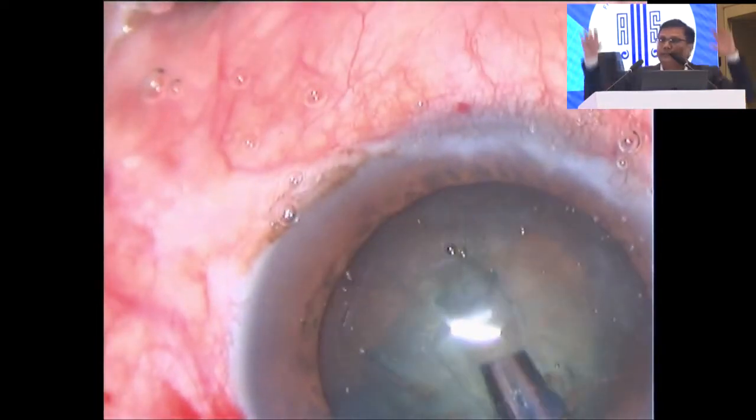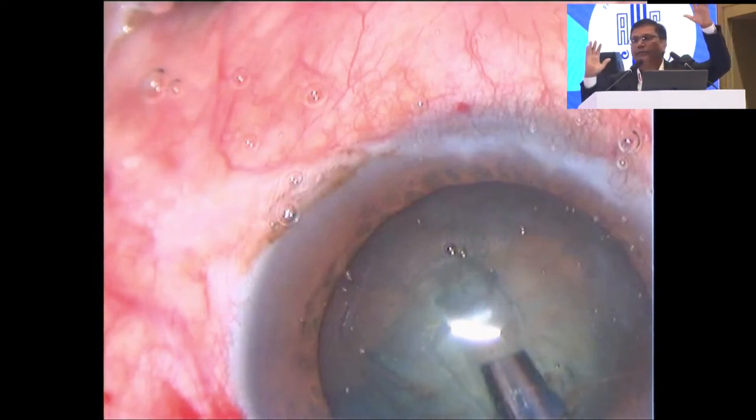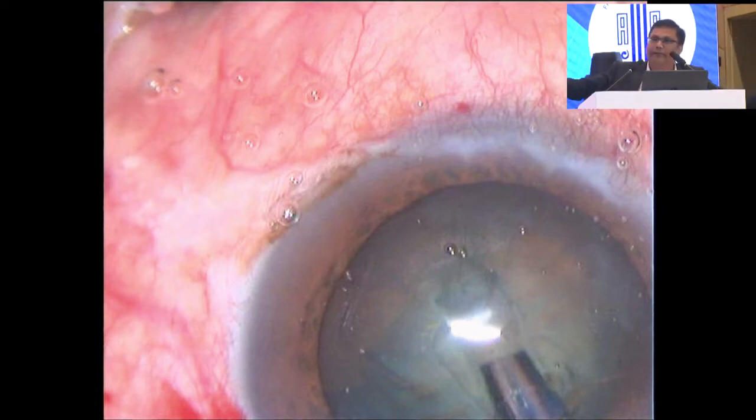There are certain points: when I am doing from 12 o'clock, if it is 6 o'clock and 12 o'clock, it is difficult. If it is a sideway capsulorhexis run away, you can manage, because the pressure of the phaco tip is not directly on the zonules. That's very important. So the site of running away of the capsulorhexis is very important.